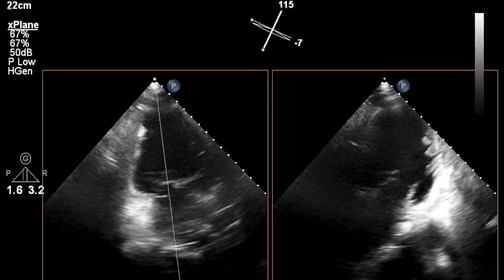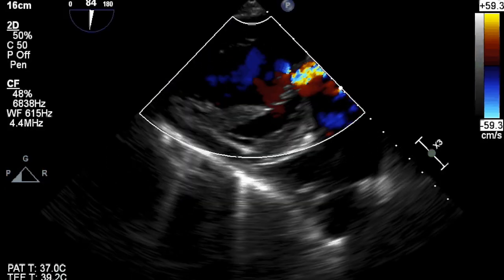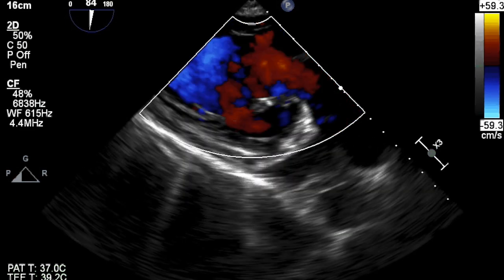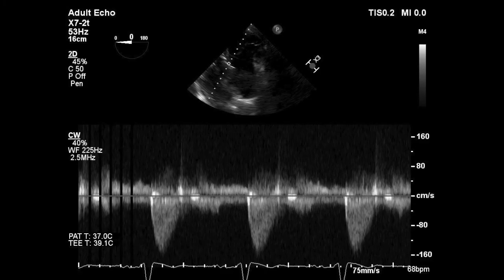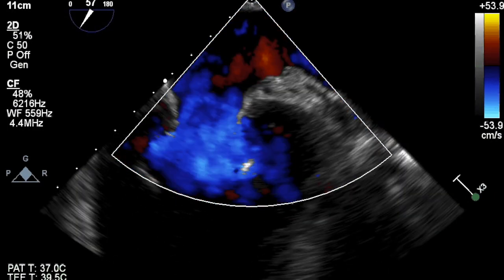the location of the transapical axis is confirmed with the transthoracic echocardiogram in the lab. A routine transesophageal echocardiogram is performed focusing on the mitral valve, evaluation of pericardial effusion, and left atrium or left atrial appendage thrombus. Transgastric view shows mitral regurgitation and normal outflow tract gradients.